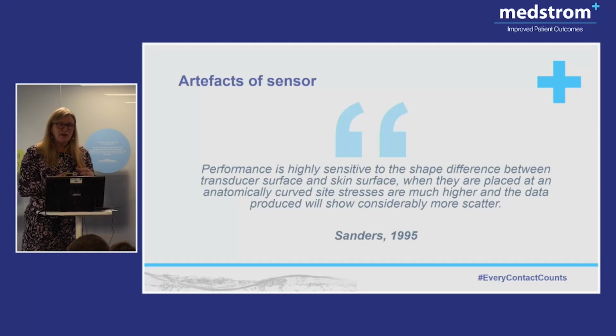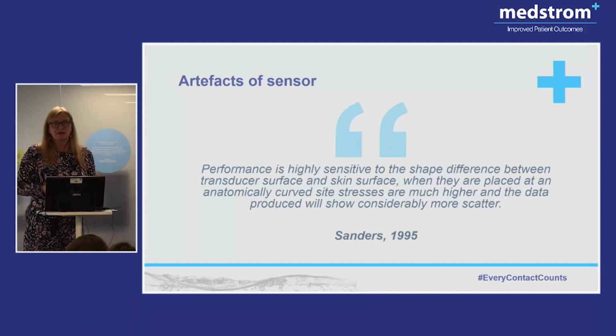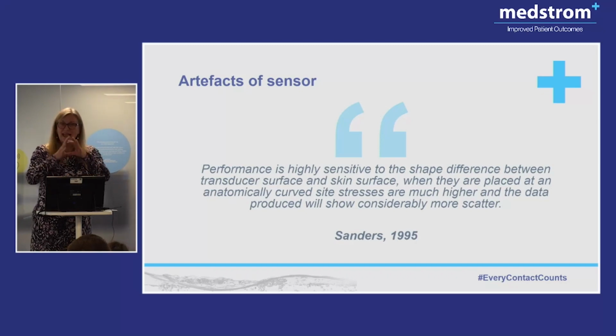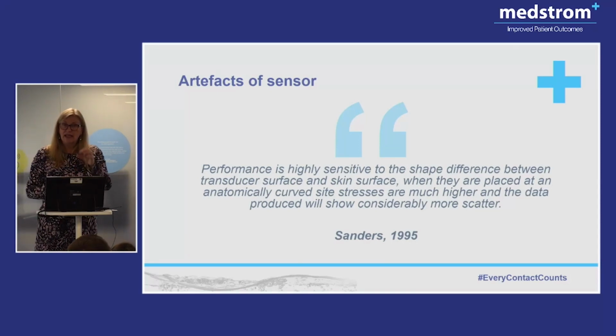So my very first ever one, which was before the one you saw that I never published, does anybody remember a Spenco mattress? Right, so we were looking at Spenco mattresses and they brought me this handheld monitor. The cells were this big. We were measuring pressure under heels and it was like a balloon. And basically it depended where you put the heel on the thing, whether the balloon blew up or not. So in retrospect, what we were doing was a bit on the dubious side, but it was a start. But there are many things about the artefact of the sensor, and the shape of the sensor and the size of the sensor really make a difference to the measurement and where you place it.